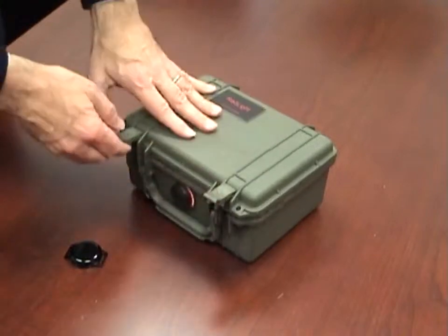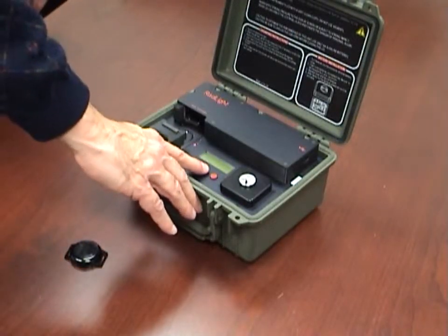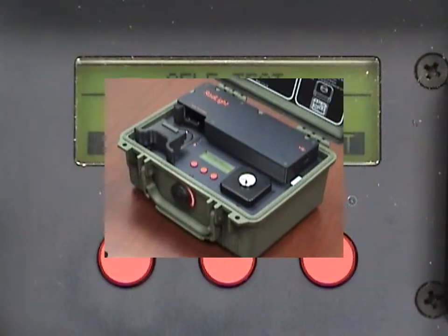Open the rad light cover by flipping up on the two front latches. Turn the reader on by clicking any of the red panel buttons.